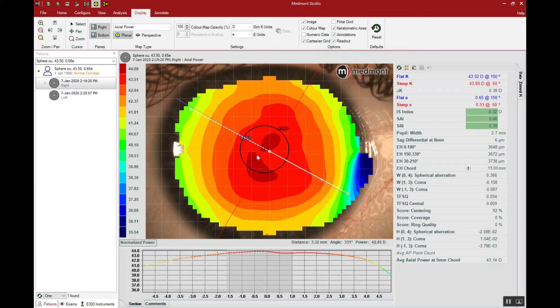So in every case, the indicators would tell us that this is a good candidate for ortho-K. We have a spherical cornea with very little corneal astigmatism to push out of the center, a corneal cap that appears well centered to the apex of the eye, and we'd expect our ortho-K lens to center in the closed eye environment. The K readings are median, corneal astigmatism is low, eccentricity is median, and our sagittal differential is low, indicating a symmetric ortho-K lens will be called for. All in all, this is a very good candidate for orthokeratology.